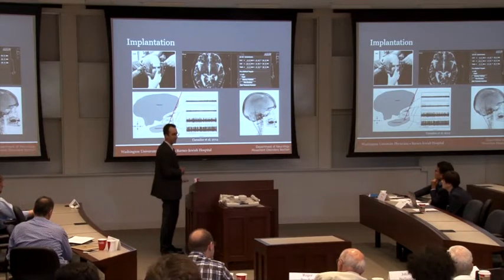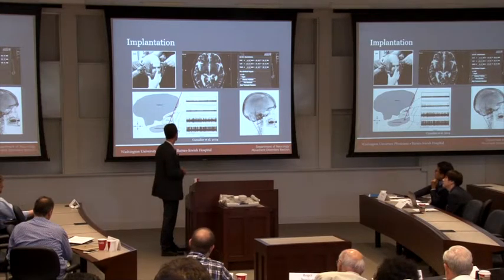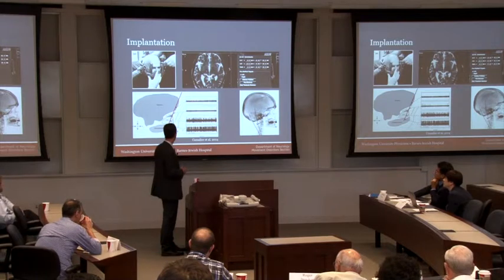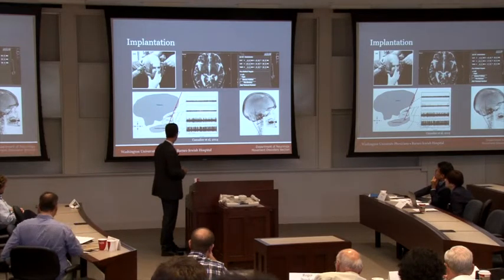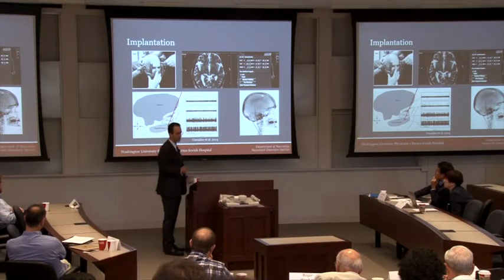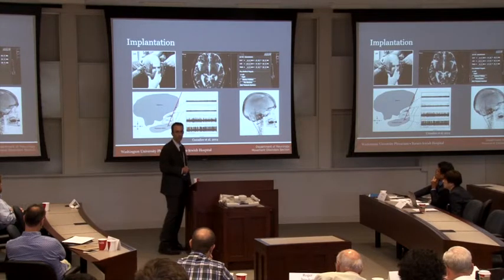For the STN, the subthalamic nucleus, a target for Parkinson's disease, we start in the thalamus. It has a very characteristic neuronal signal. I can hear that on the audio, and I can also see that on my screen. We pass through structures, kind of a white matter track, that divide these areas. We lose our signal, and then once we enter our target, we have a very characteristic pattern. We're able to map the top, the bottom, and then we calculate the middle, and we place our electrode right there and get the optimal stimulation.